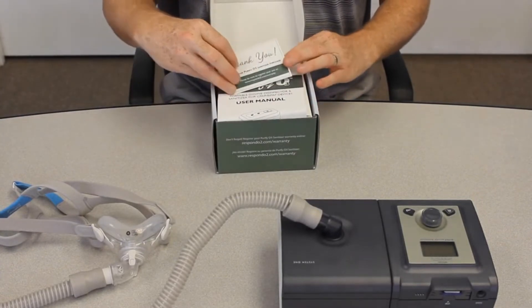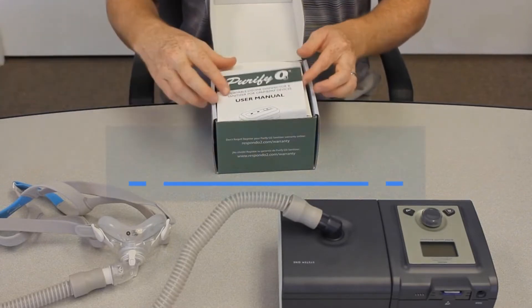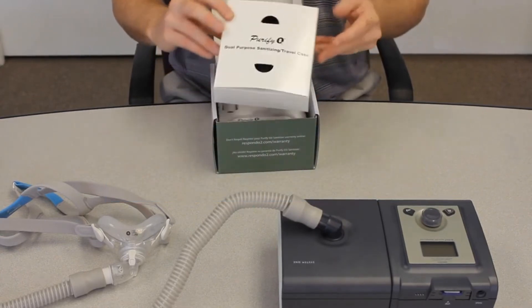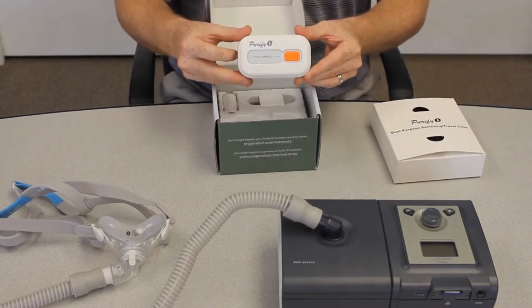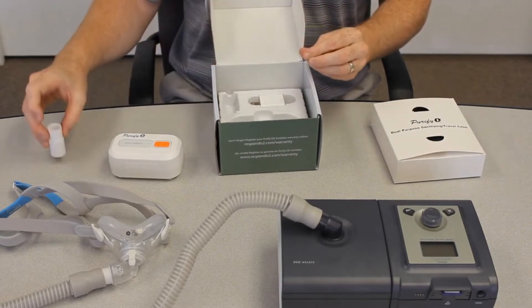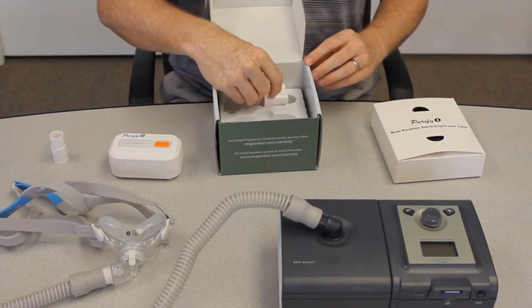It comes with a little thank you card along with tips for the patient, a bilingual user manual, the dual-purpose sanitizing and travel case, the Purify O3 unit itself, a universal adapter for heated tubing, as well as a charging cable that uses a mini USB.